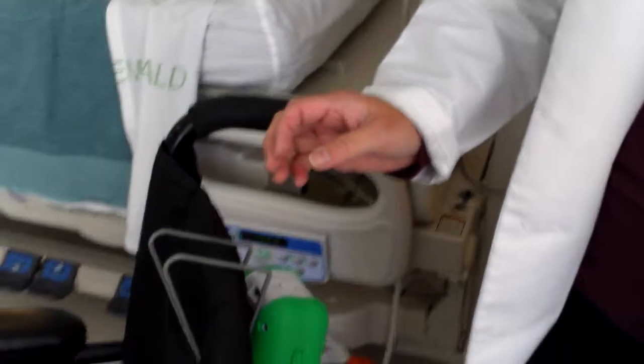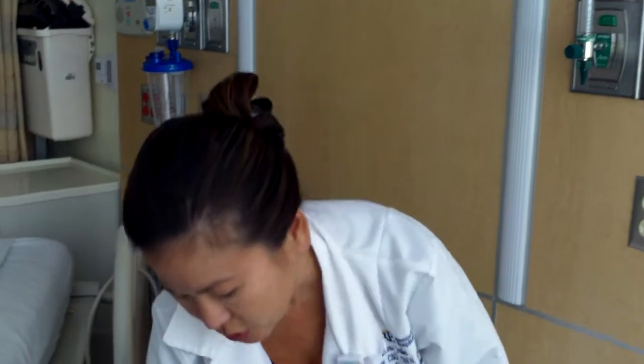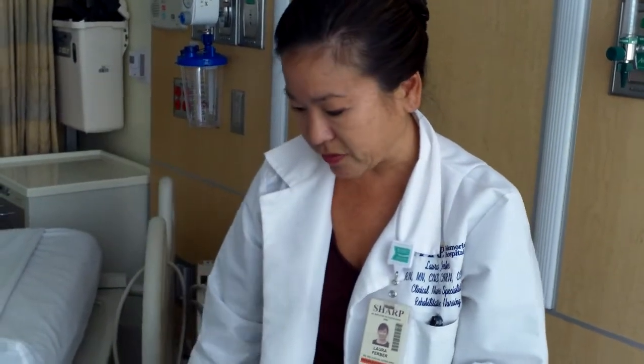One thing that you need to know about this is when it does alarm and alert the nurse station, it comes off as a regular patient call. So it's not an emergency, staff emergency like it does with the bed alarms. You just have to be cognizant of that. So don't expect the lights to be flashing, or the dome lights to be flashing.